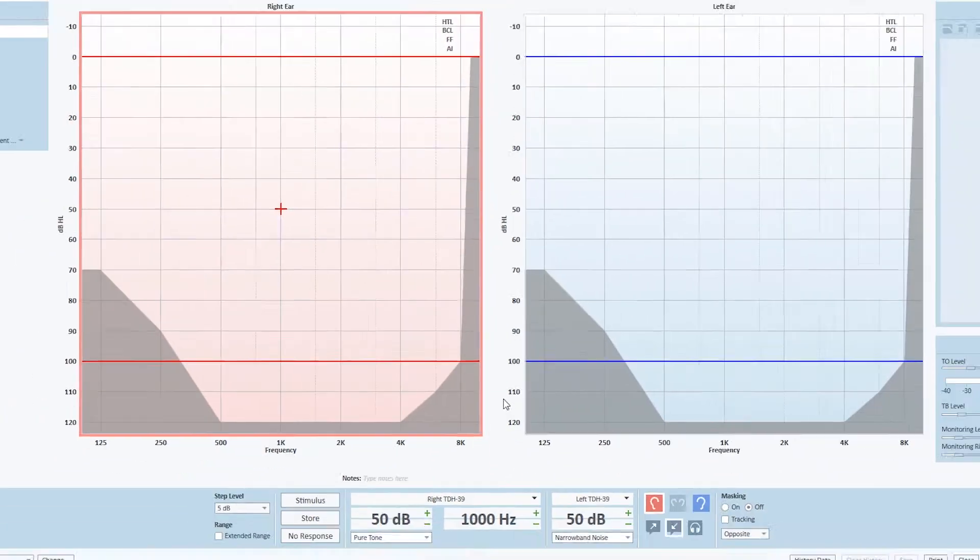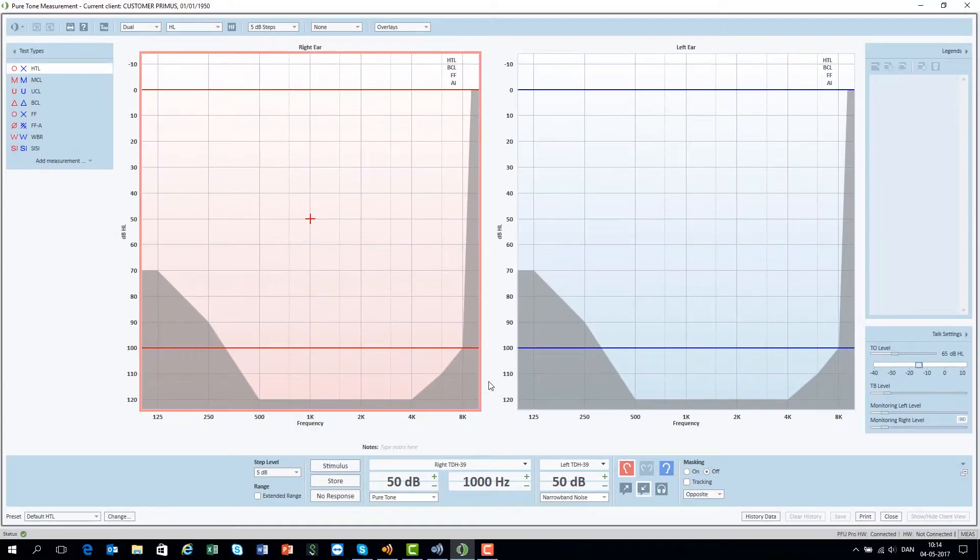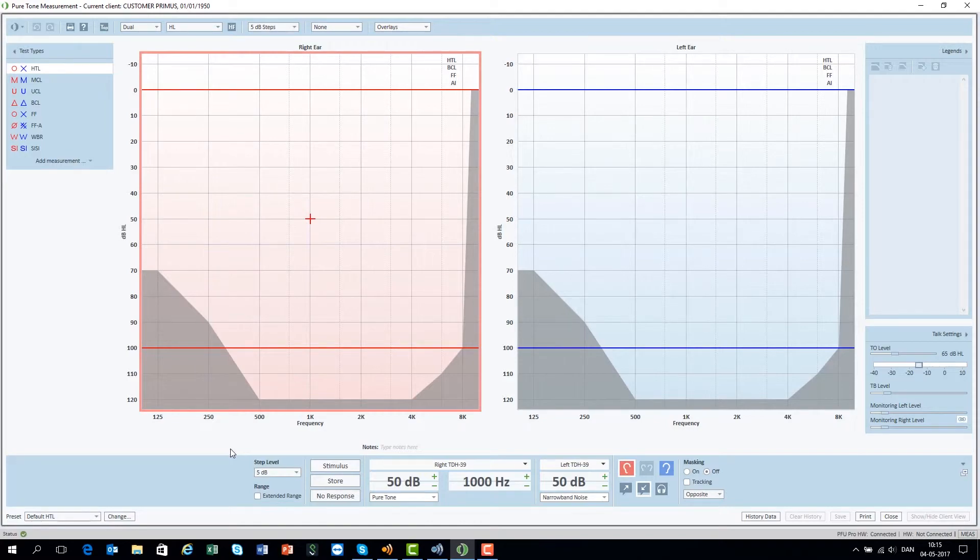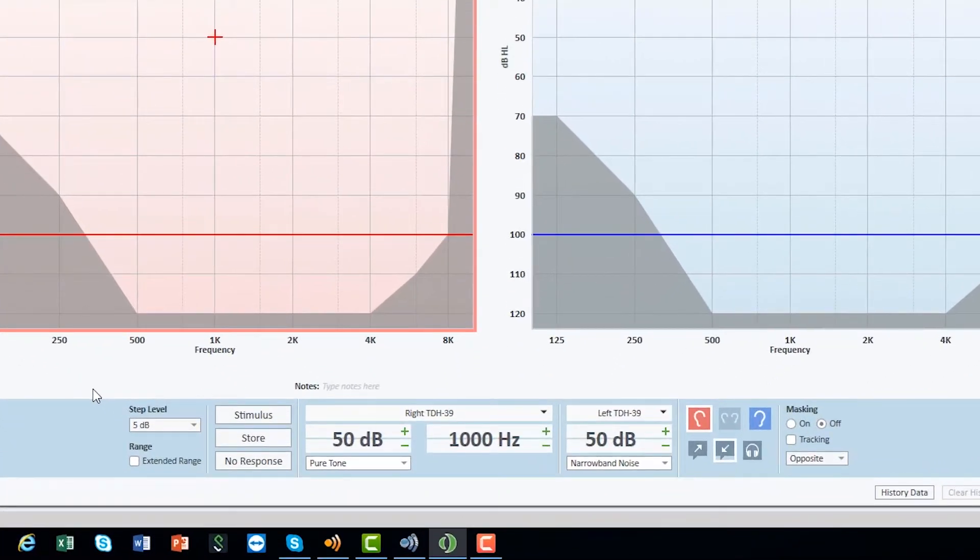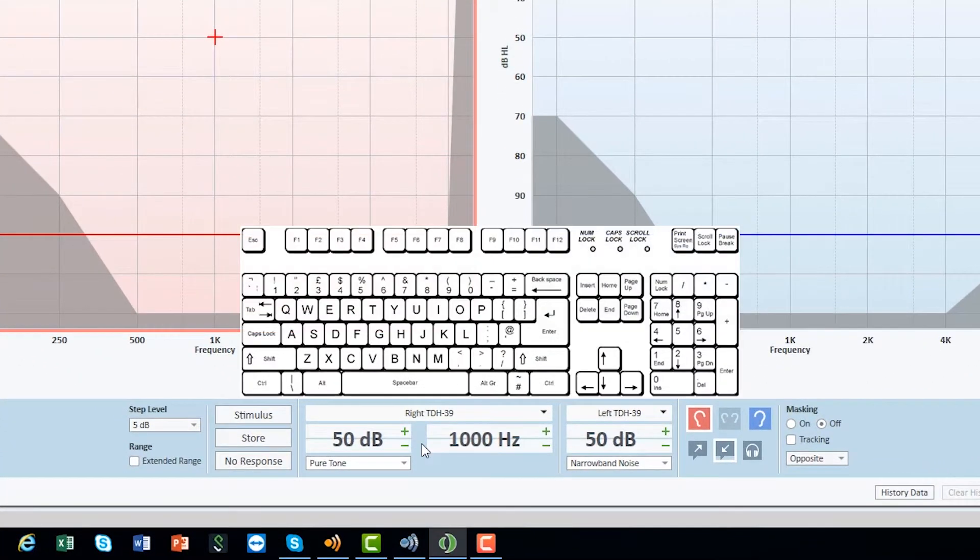The Primus control panel can be operated either by using the mouse or, most efficiently, by using shortcuts. For stimuli, use the space bar.